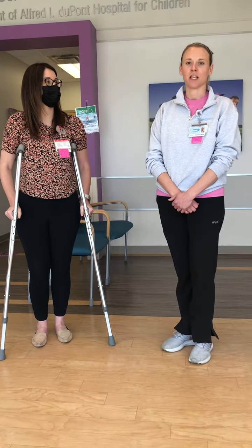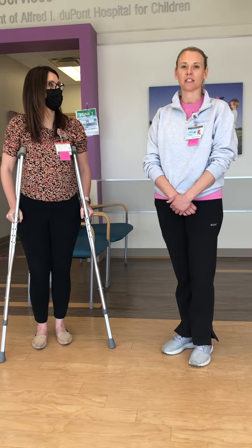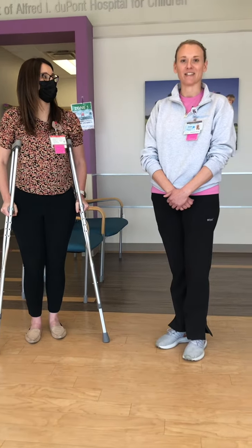Good afternoon. Today we're going to go over crutch fitting and crutch training for developmentally appropriate patients 11 years of age and older.